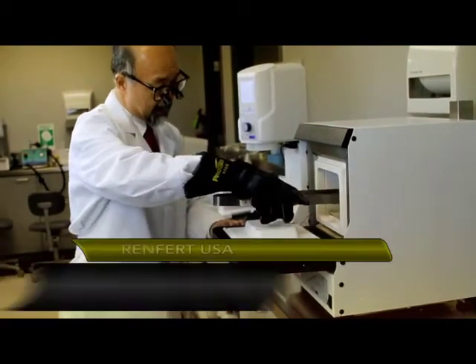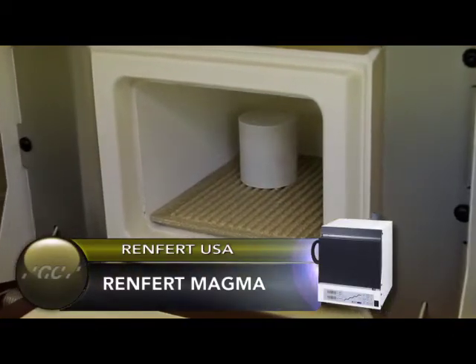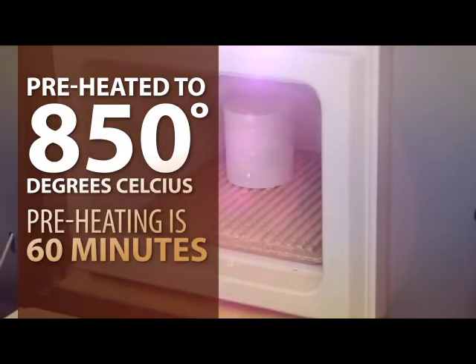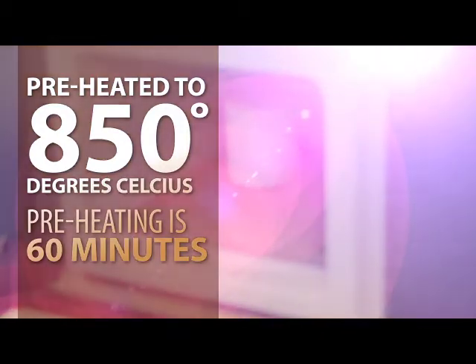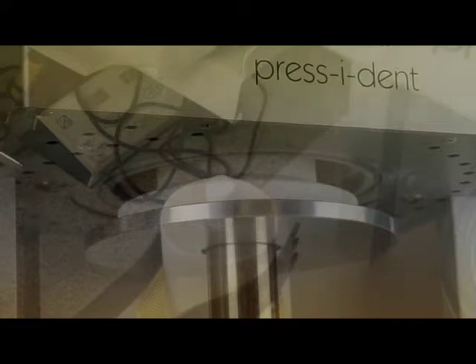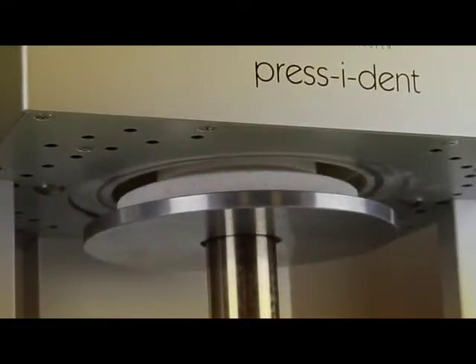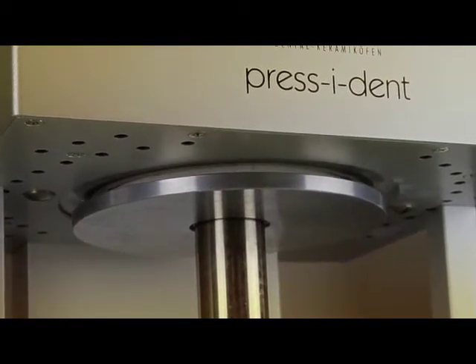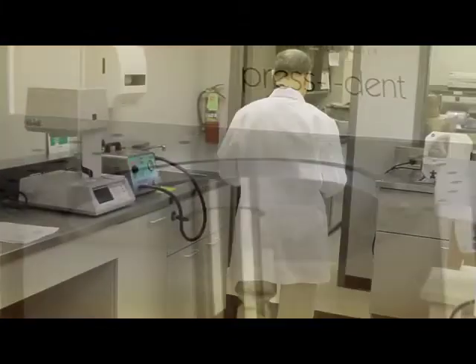After 20 minutes, put the investment ring with the funnel pointing downward centrally in the furnace, preheated to 850 degrees Celsius. Preheating is 60 minutes. If there is more than one ring in the furnace, each holding time should be extended by 10 minutes per additional ring. Note that the Initial IQ ingots and plungers do not need to be preheated. The time and temperature will depend on the ring size being used; please refer to the GC Initial IQ Manual. It is very important that all pressing ovens are regularly calibrated. If the ingots are fired at a lower temperature, this may change the CTE causing cracks and chipping.